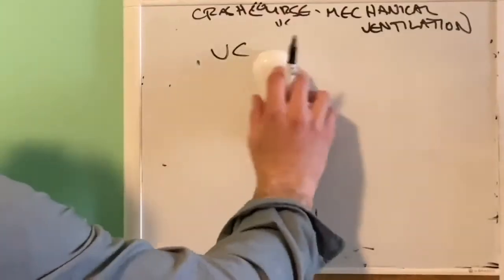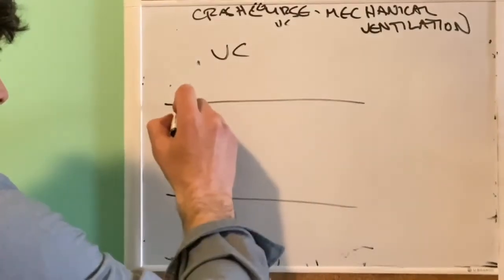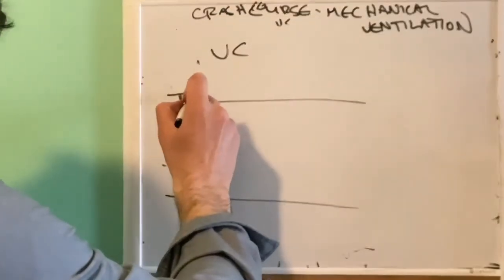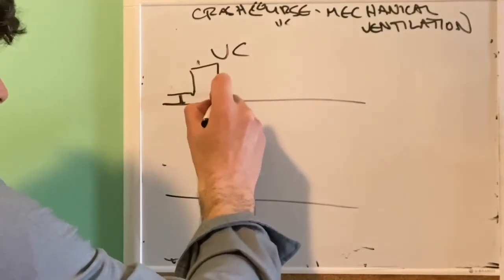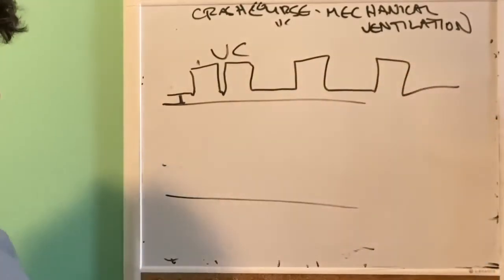You'll see on vents this, all right? Often, now we'll say it's pressure control, but you'll see, let's give the patient a little PEEP, like real life. This is a common one encountered, all right?